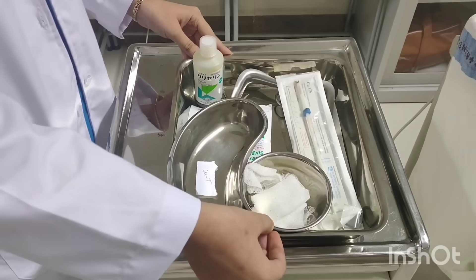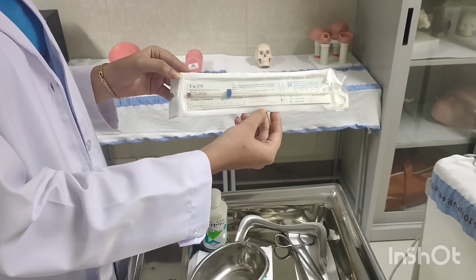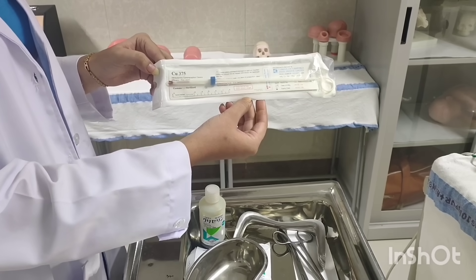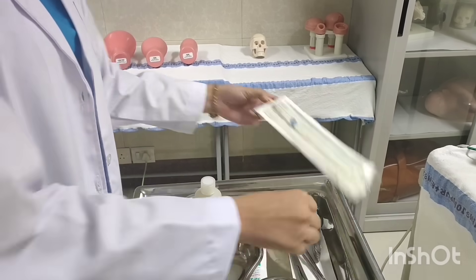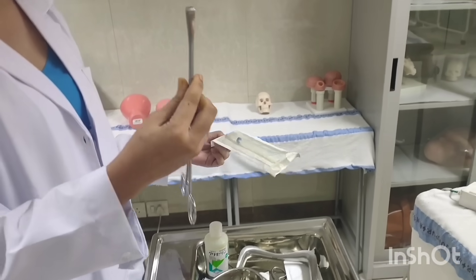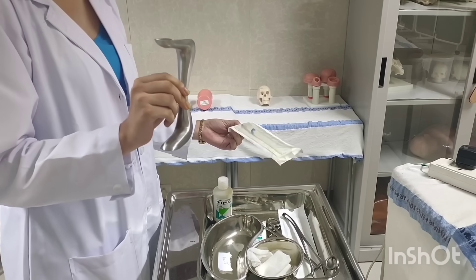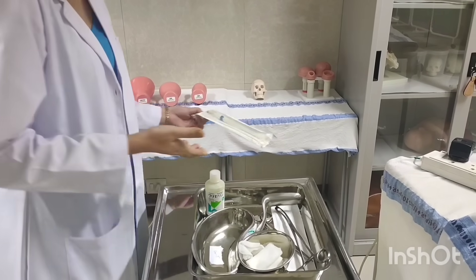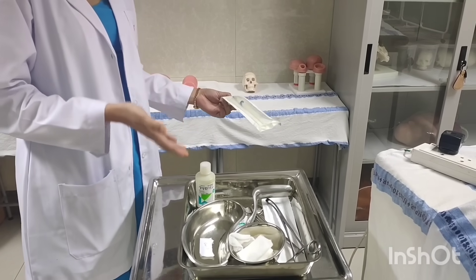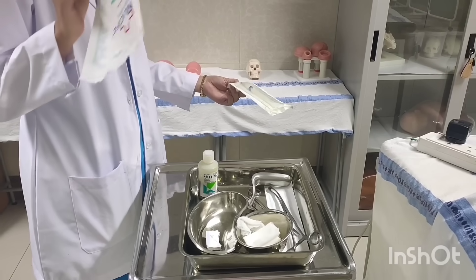In the tray, this is the kidney tray, this is the bowl with gauze pieces, copper T — we are using Copper 375 — then the valsellum for holding the cervix, the Sims speculum, the solution — normal saline or betadine — and some surgical gloves.